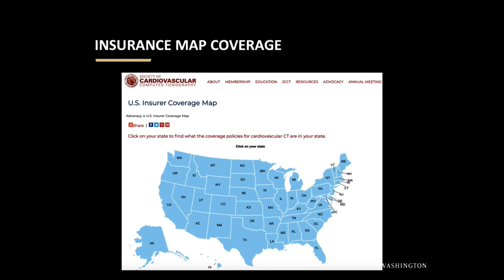But there is some work I know with the PROMISE trial and using a PROMISE score to see if we can better risk stratify these patients and try to avoid a CT scan. Because ultimately the question is, we just want to get them on medical therapy and target the right patients with the right therapy. And how can we best do that? If that can be done non-invasively with a score, that's great. But I think right now this is the most convincing data that shows that CTA seems to do this the most efficiently, but there is some work being done looking at other tools and scores.